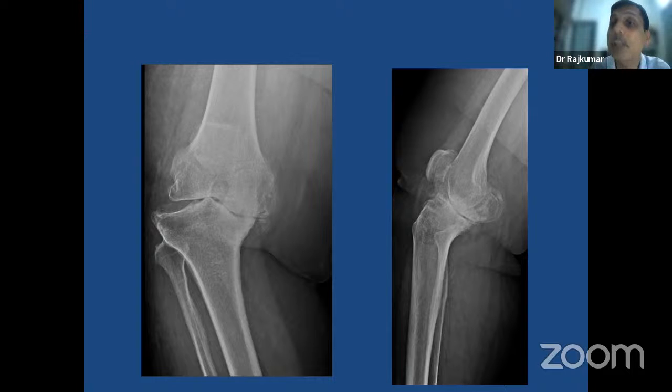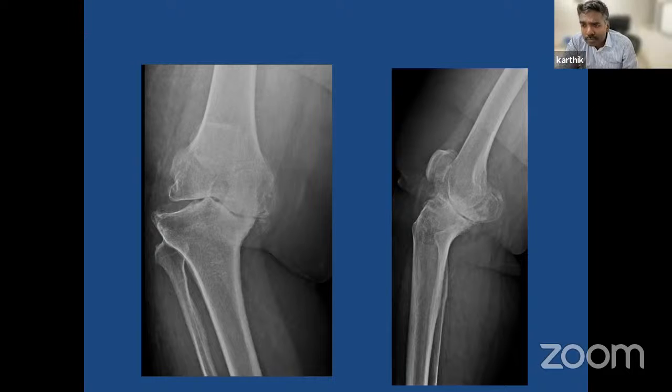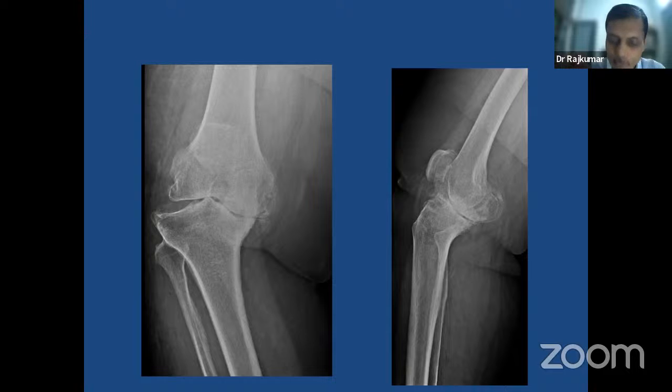Then post-operatively it will stretch out, and in the post-operative x-ray, suddenly the lateral side will be opening out. After it happens, it is very difficult to manage. How can you go and tighten it on the lateral side? I don't think that will help you in a big way, and all your bracing is only for your mental satisfaction. So what I will suggest here first is to make a very, very minimal cut. Then you end up with minimal poly, and your balancing will be okay.